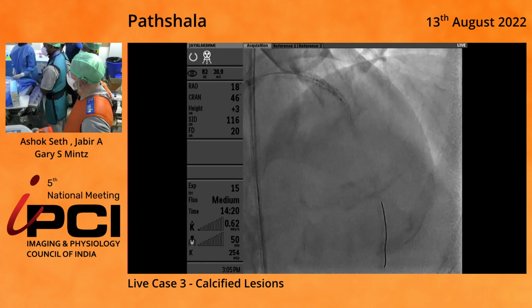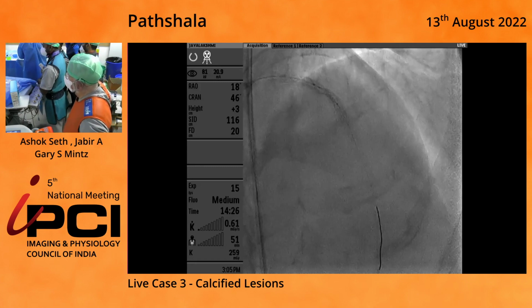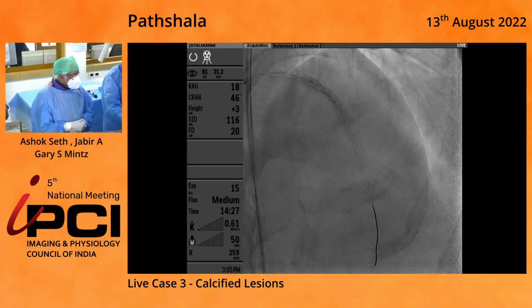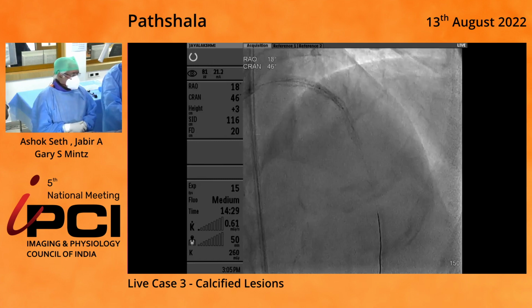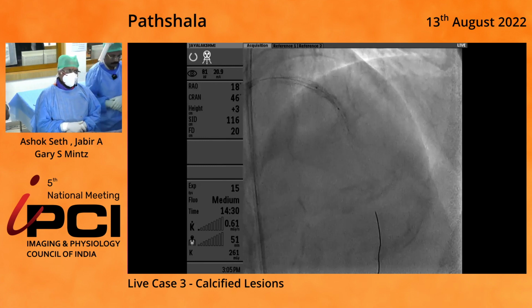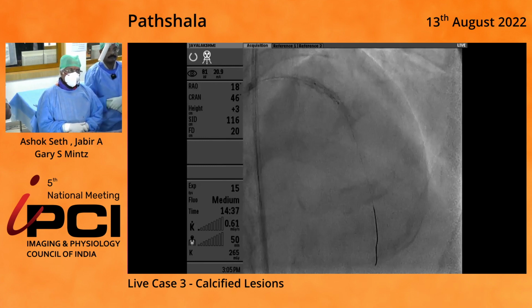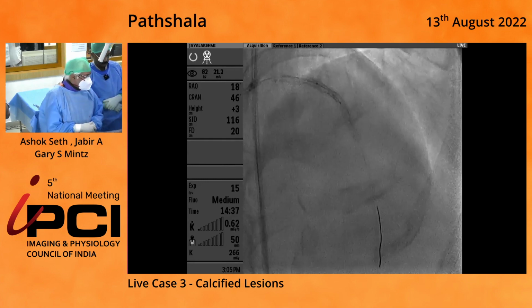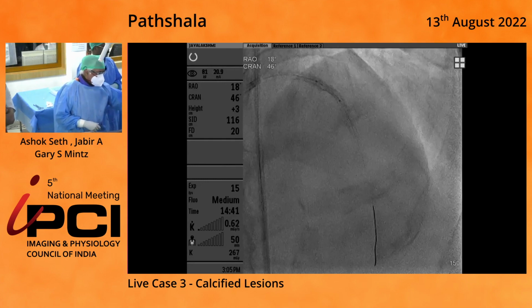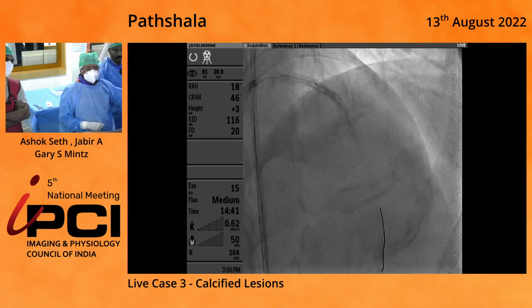At the moment, I have the 2 markers of the balloon on either side of the underexpanded stent, the double layers. But after a couple of pulses in this, I would move my emitters to that side to deliver the maximum impulse, should we say. So here we are. Can we switch the IVL on? Switch that button on? Yeah. Okay. So here we are delivering the IVL, and I'll do it on the fluoro, or I can even do it for you.